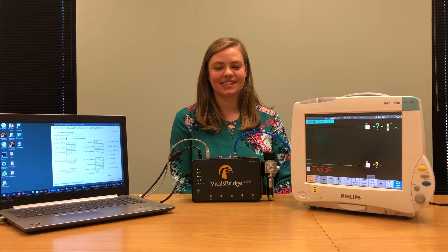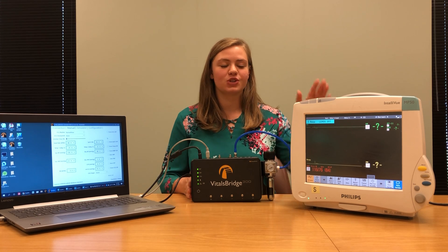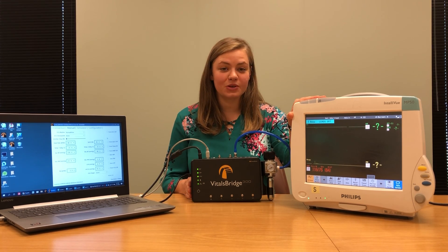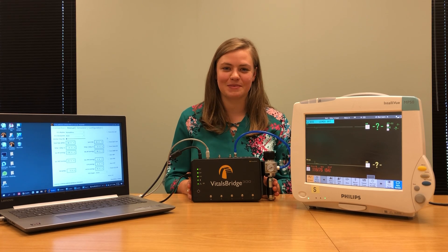Hi, my name is Haley and today I'm going to show you how to connect your VitalsBridge 300 unit to a Philips IntelliView patient monitor. This video can also be used to help you connect your VitalsBridge 300 to most Philips patient monitors as the connections that we're going to make are very similar.